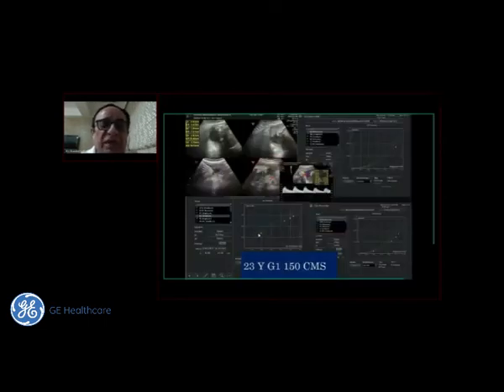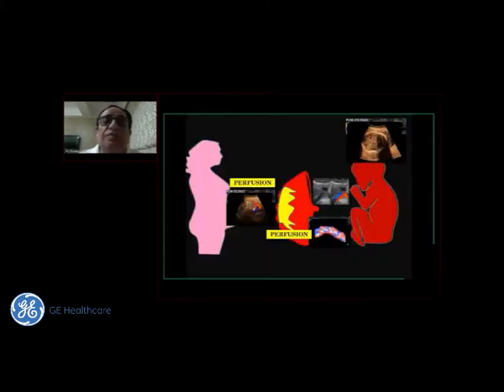So here we have a fetus which started on the 50th centile, but this lady is 150 centimeters in height. Subsequently she has dropped, but she is growing on the 5th centile, and the Doppler is normal. So here I would consider this as a small for gestational age, and there is no Doppler alteration. The interval growth is good. We're not worried. This baby may not have a poor perinatal outcome.